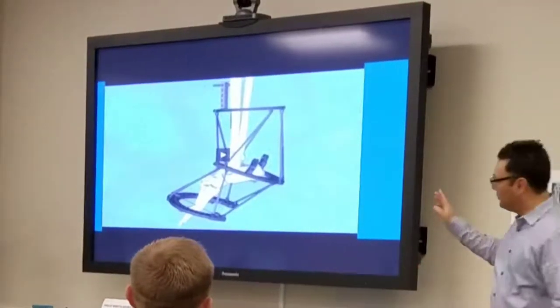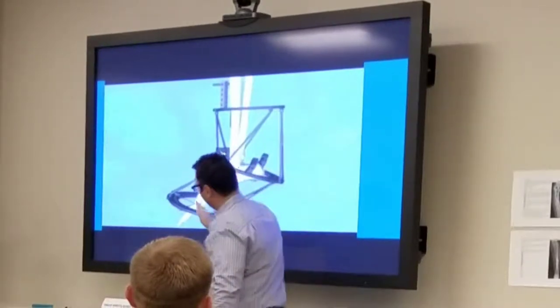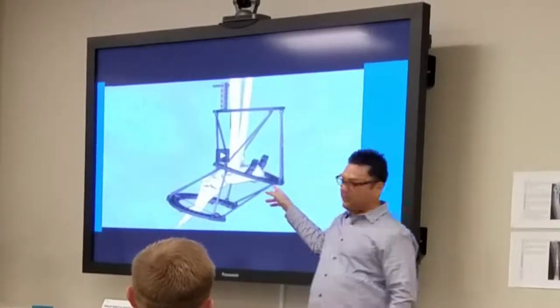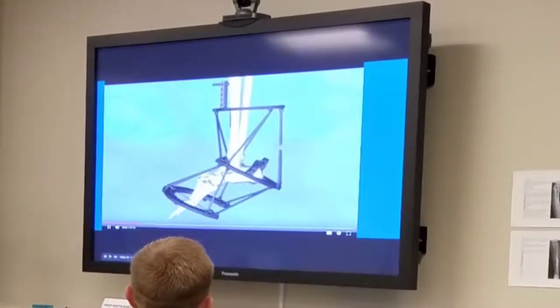So here's what a miter frame looks like. See that 45 degree angle joint over there? Now the miter frame doesn't have to be exactly 90 degrees, but this is kind of what it looks like. So this is a cavus to rectus foot correction. You can see how it's moving. You see how it's correcting that.